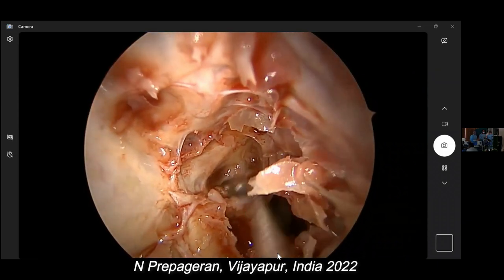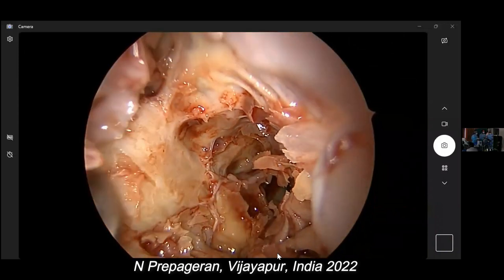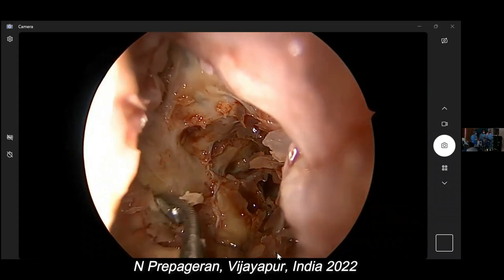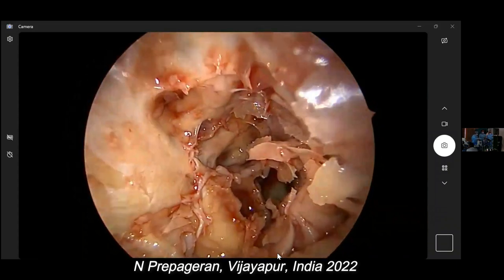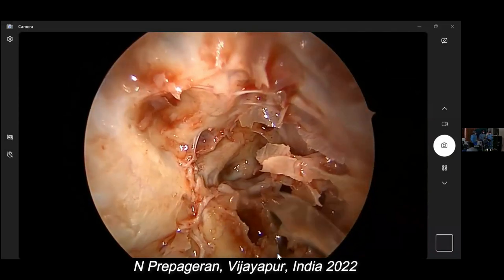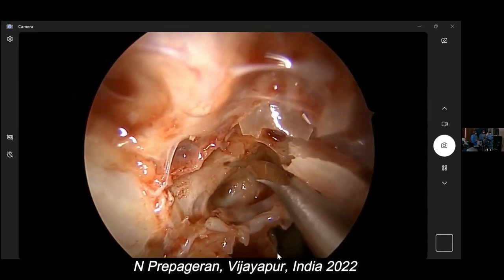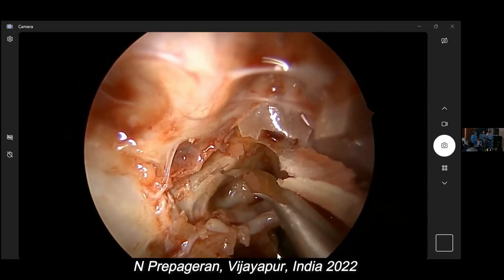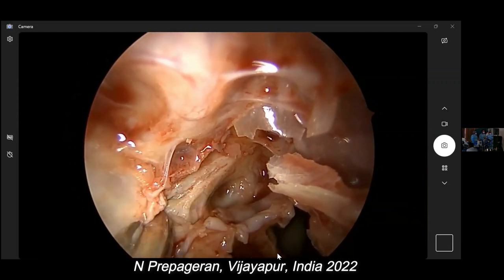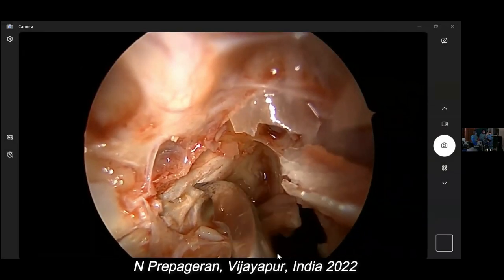Sickle knife now. The same way, when you do this, make sure you stay away from your scope because it's very easy to accidentally injure your scope, okay? So what we're going to do now, I want to show you, this is the ligament of Zinn here. So I'm going to cut the perineural sheath. You need to cut quite a lot before you can see the nerve. There, see, you're not seeing the nerve yet.